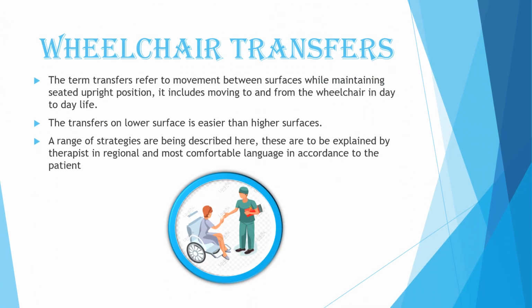Wheelchair transfers. The term transfers refers to the movement between surfaces while maintaining a seated upright position. It includes moving to and from the wheelchair in day-to-day life. Transfers on lower surfaces are easier than on higher surfaces. A range of strategies are described here. These are to be explained by therapists in the regional and most comfortable language according to the patient.